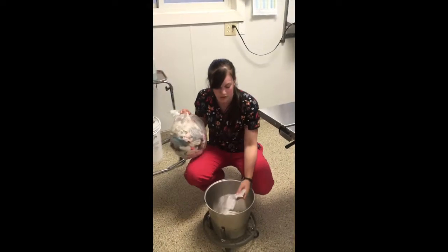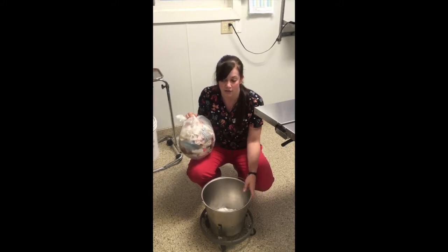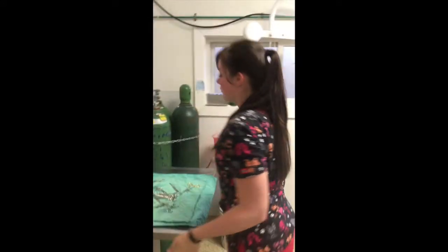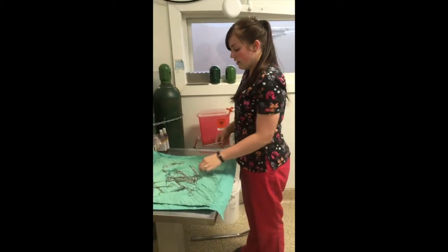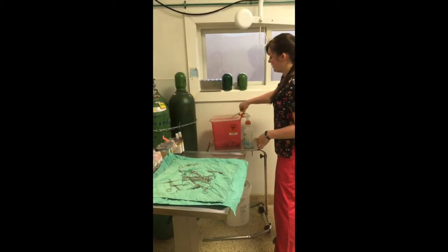And then we have more bags in the bottom of the treat bucket for the next day. We'll put a new bag in, so that will go out to the garbage right here. All right. As for our sharps, doctors leave the sharps. So the sharps, we want to make sure that we take off of the instruments and that the sharps are disposed of in appropriate sharps containers.